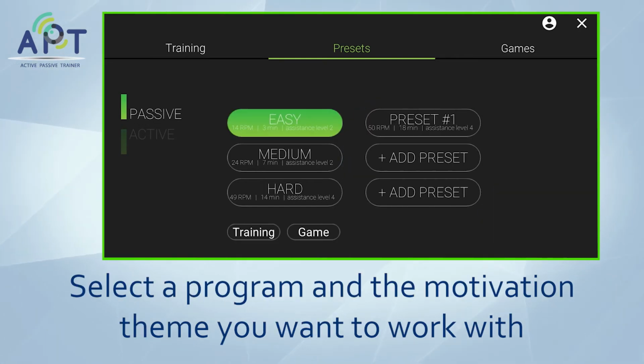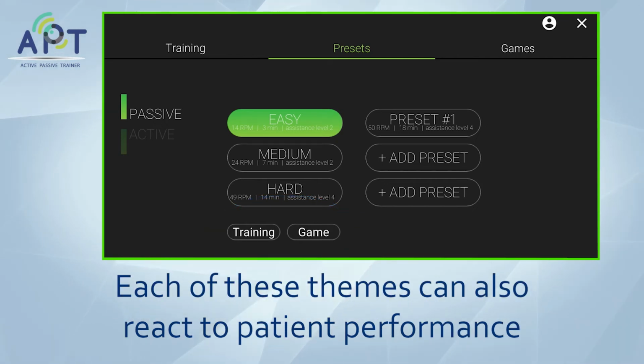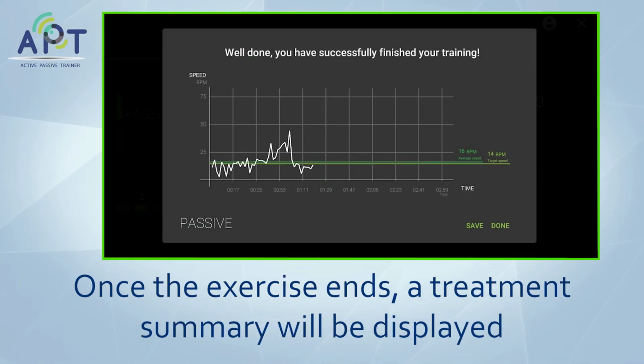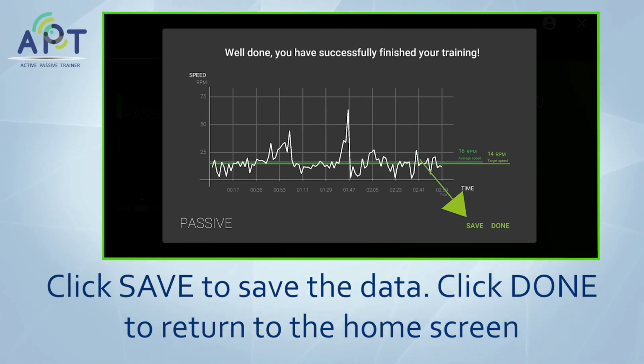Select a program and the motivation theme you want to work with: gaming, trip, or against the clock. Each of these themes can also react to patient performance. Note that in case you stop pedaling, the exercise will be paused. As soon as you pedal again, the exercise clock will start running again too. Once the exercise ends, a treatment summary will be displayed with an analysis of your performance throughout the exercise. Click Save to save the data. Click Done to return to the home screen.